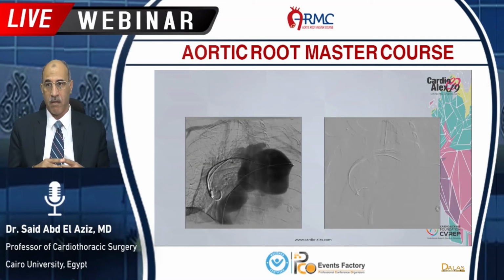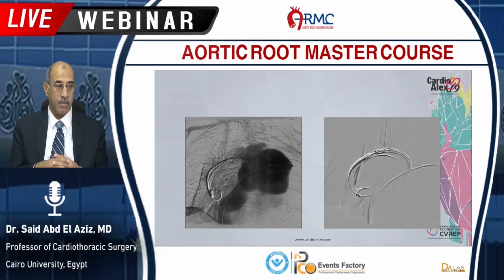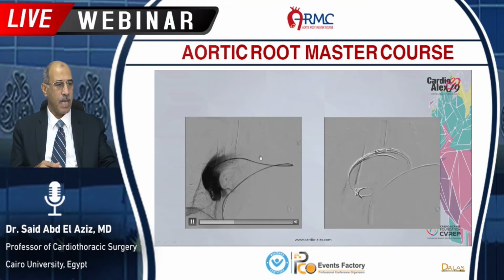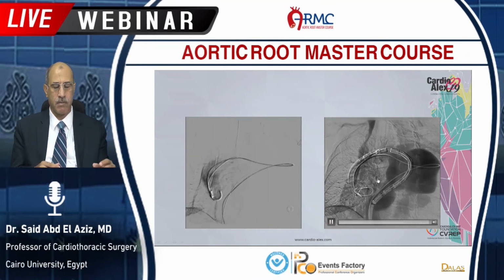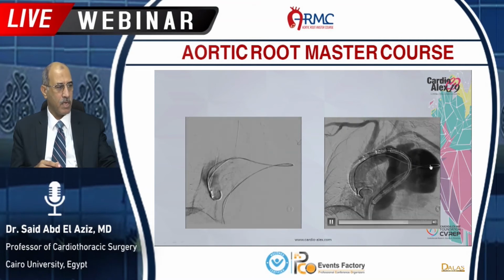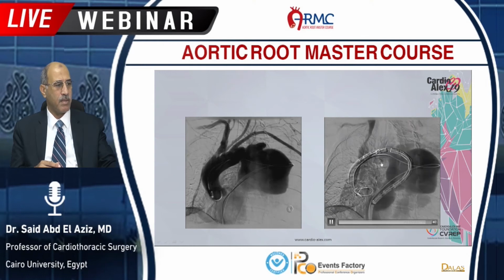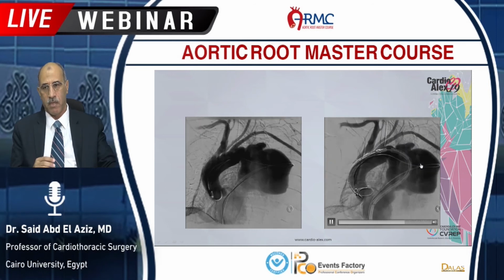one of the selection criteria is the angulation of the descending thoracic aorta. You see here how the descending thoracic aorta is tortuous, and the angle of the arch is a very acute angle. This makes it very difficult to put the stent during the procedure. And here you look at that wire, it goes around the aneurysm till it goes here. This truly makes it very difficult during the procedure.